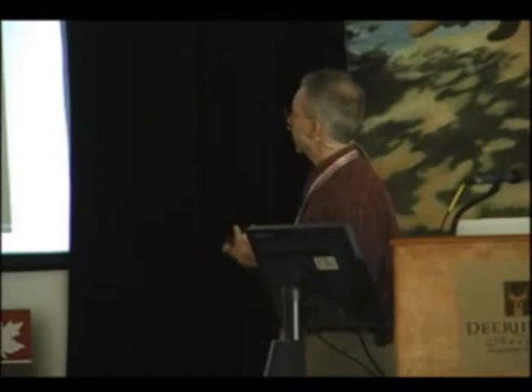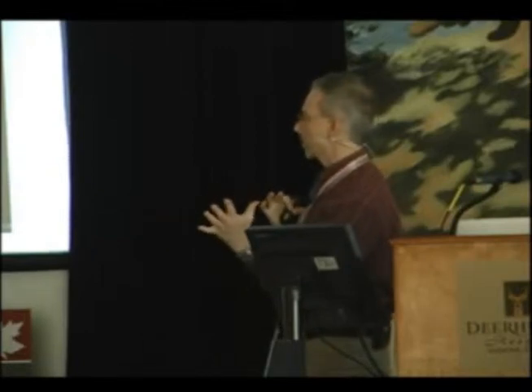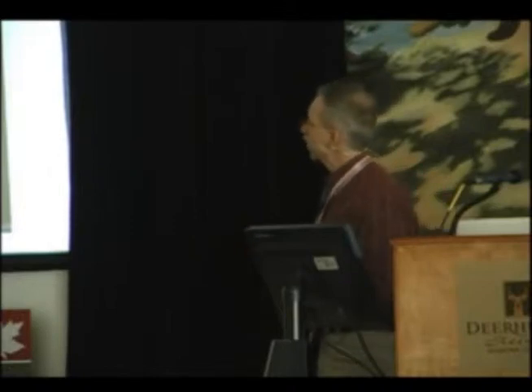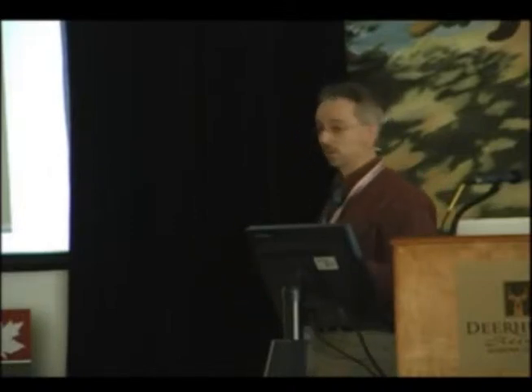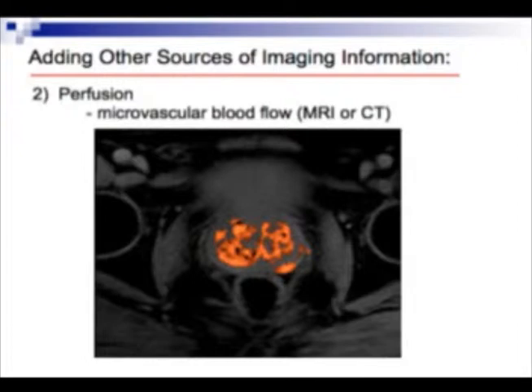So here's an example. We have a PET-CT at St. Joe's as well, and this is an example of some PET-CT data scaling from the CT side, which is high-resolution anatomic data, putting down the metabolic information data where the yellow hotspots are metabolically active parts of the tumor. So that's one modality we can then bring in as another source of information to provide to a multimodal platform, metabolic information.